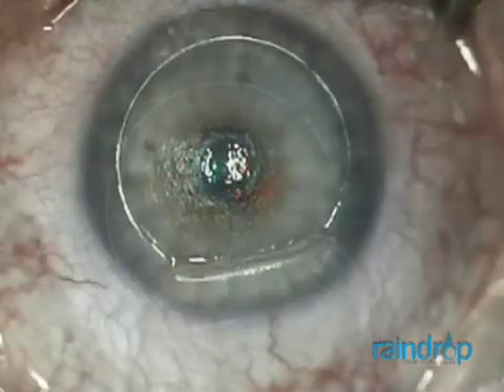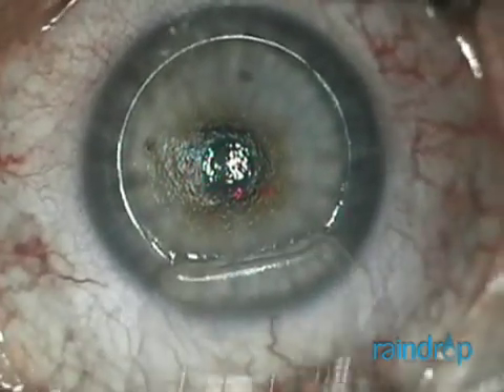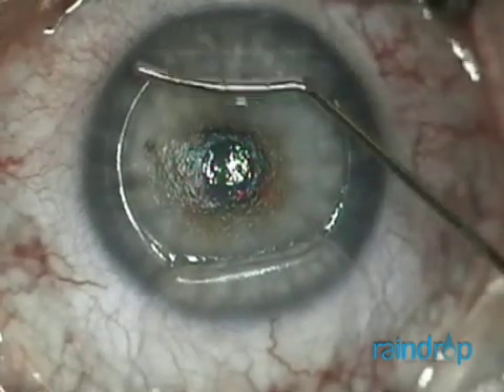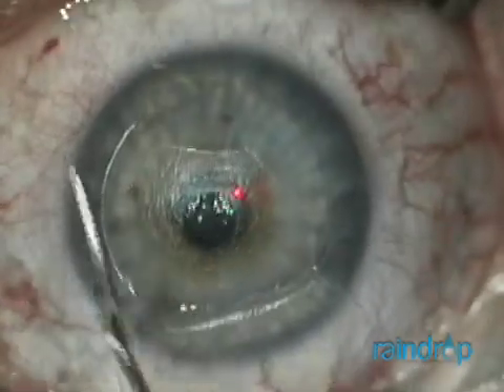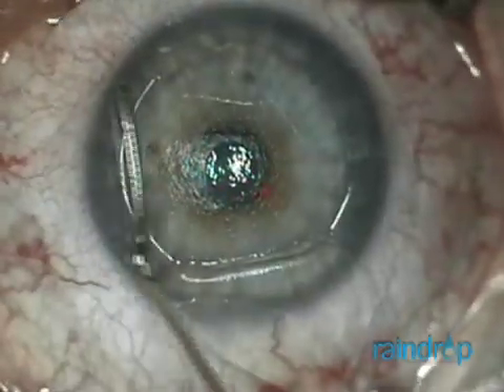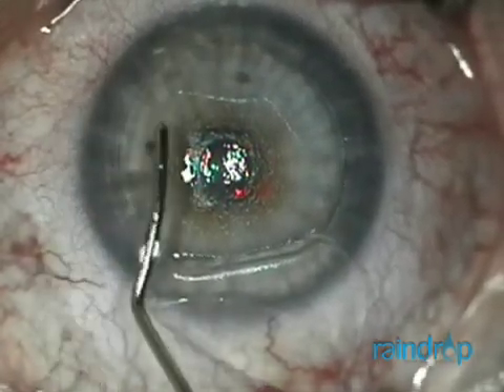I maintain hydration on both the epithelial and stromal side of the flap and around the inlay during this drying time. The drying time is longer than a typical LASIK, and you don't want the stroma and the flap to dry out. I find hydrating the periphery of the stromal bed removes foreign debris and helps in repositioning the flap for rapid visual recovery without stria.